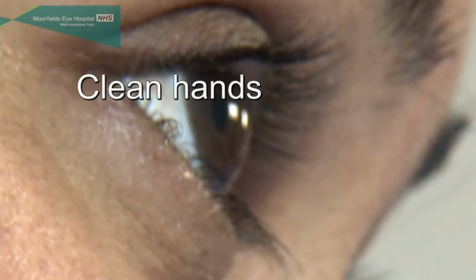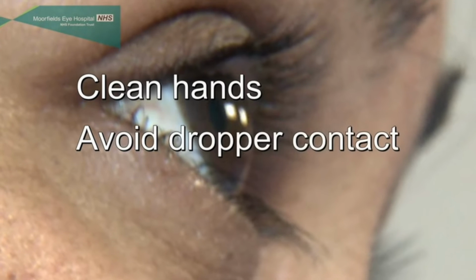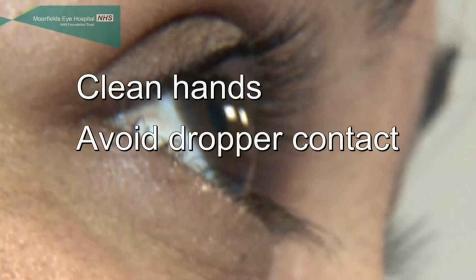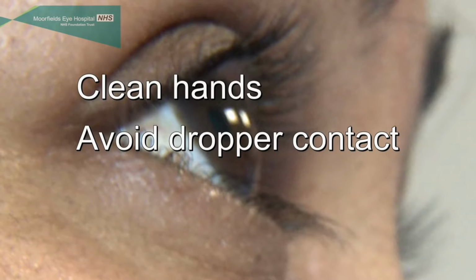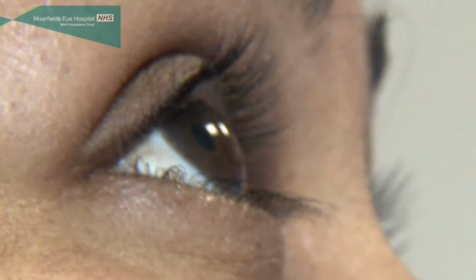Before putting an eye drop in pediatric patients, never forget to wash or disinfect your hands. Always be careful not to touch the dropper to the eyes or surrounding tissue, to avoid hurting the eye and contamination of the drops. And don't worry if the occasional drop is missed.